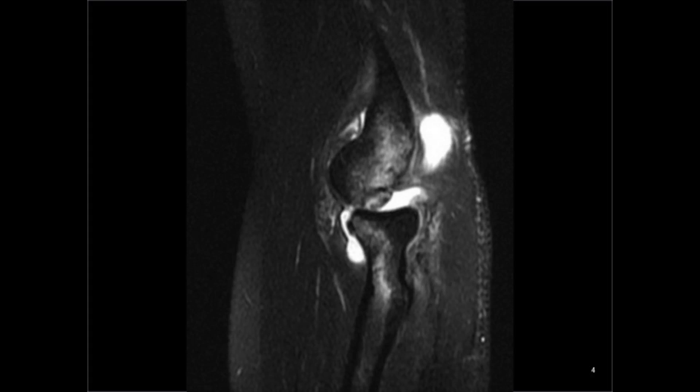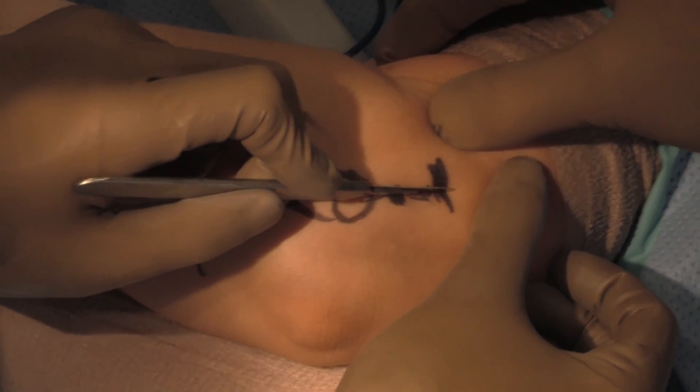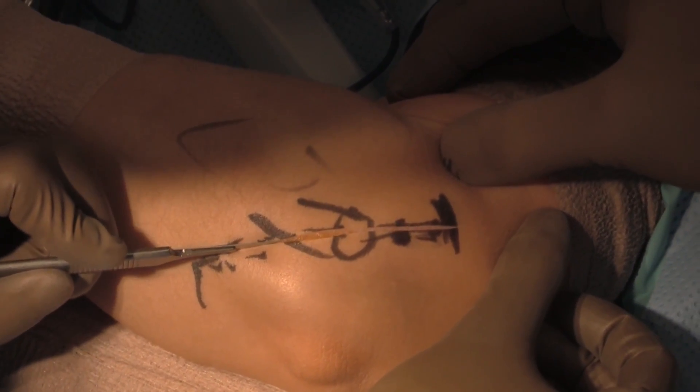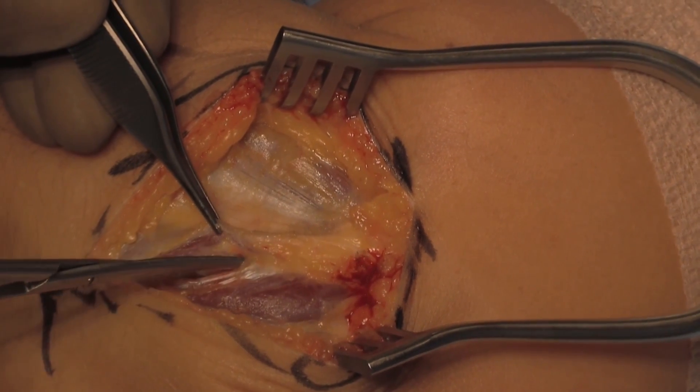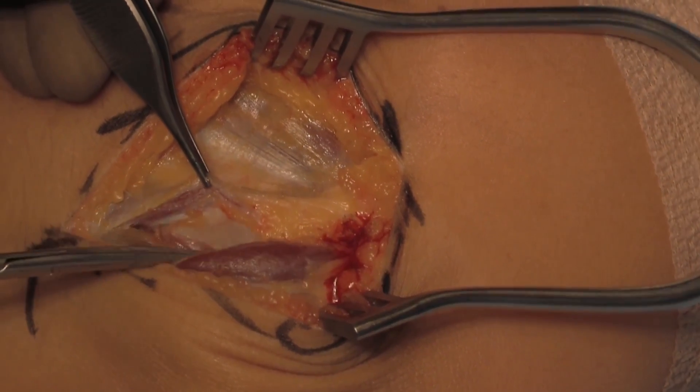MRI confirms the capitellar impaction fracture as well as the lateral ulnar collateral ligament tear. An incision based just anterior to the lateral epicondyle was performed, with the incision extending to the lateral aspect of the ulna.